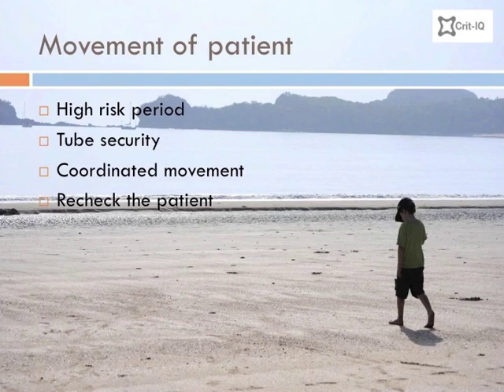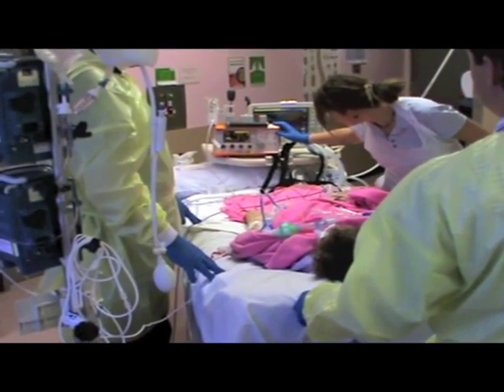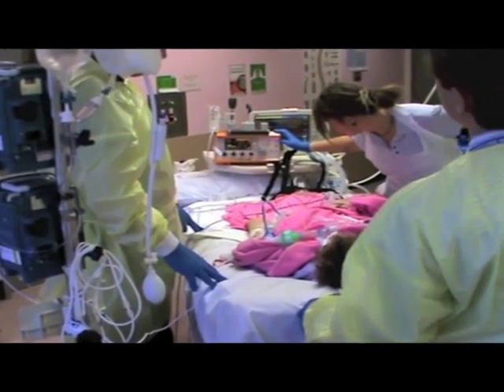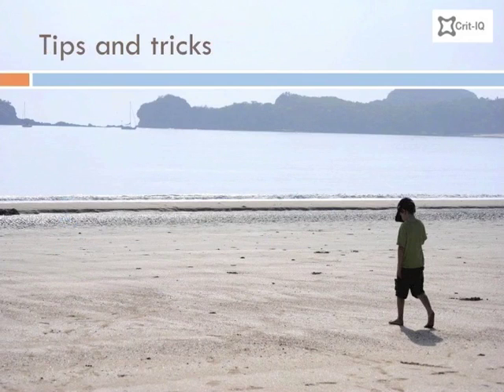Develop a habit of checking the patient whenever moved, and at important times such as immediately prior to departure. Quickly review the A, B, C, D algorithm to ensure that there are no significant changes. Consider holding the tube as you transfer the patient through important transitions, such as bumpy surfaces and moving in and out of vehicles.